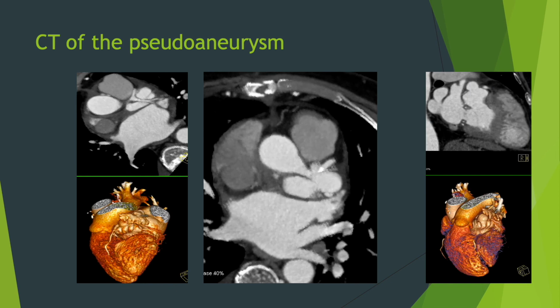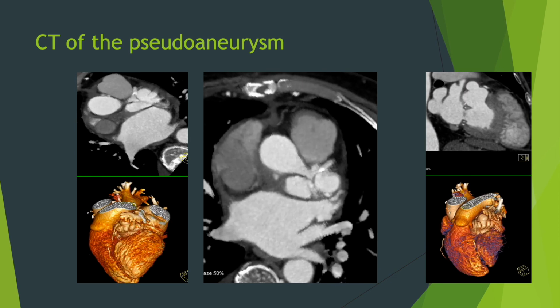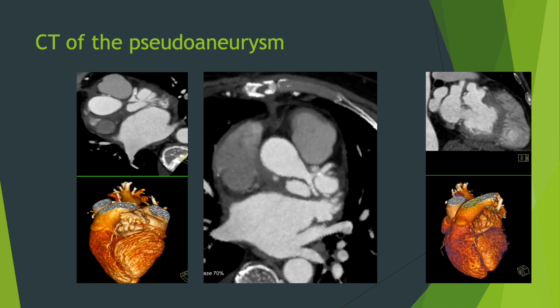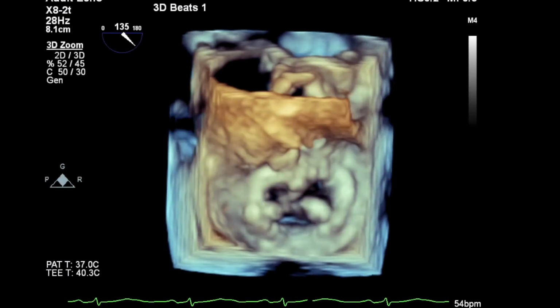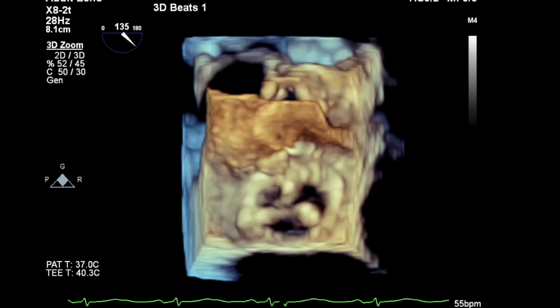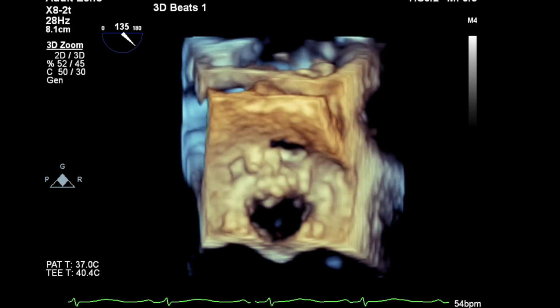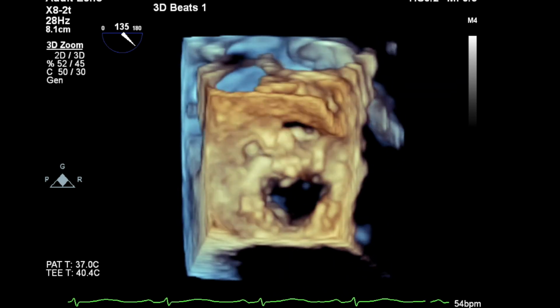But as we treat the... can you orientate us, Bushra, on that echo? So go to echo. Okay, yeah. So if we go to echo, okay, so the aortic valve in that view is at 12 o'clock. Yeah, that's right. Is this a surgical view? Yeah. So this is a surgical view. So this is our standard clock face.